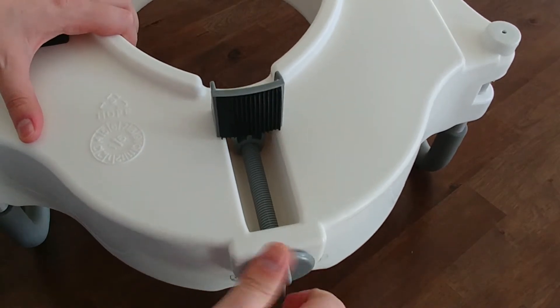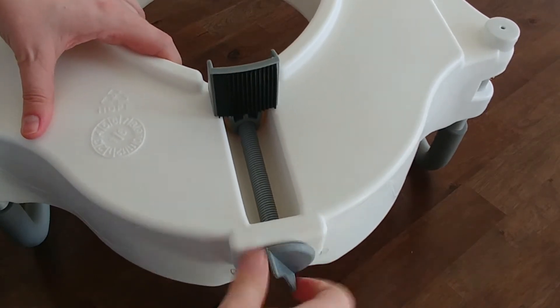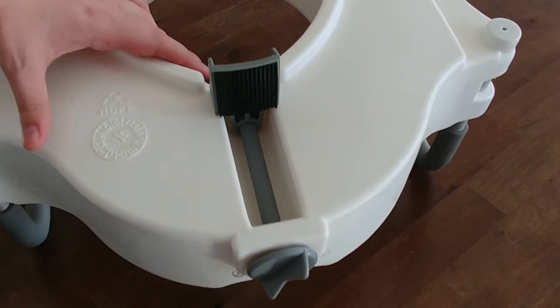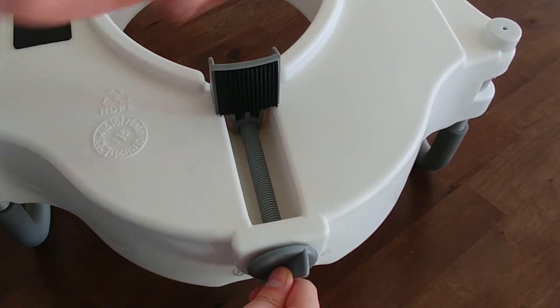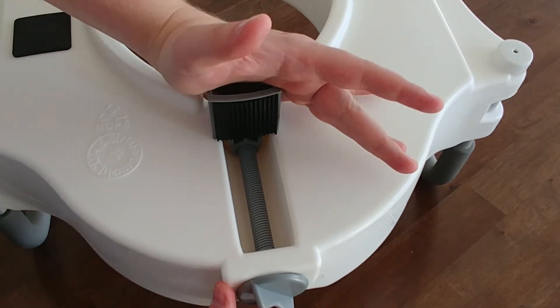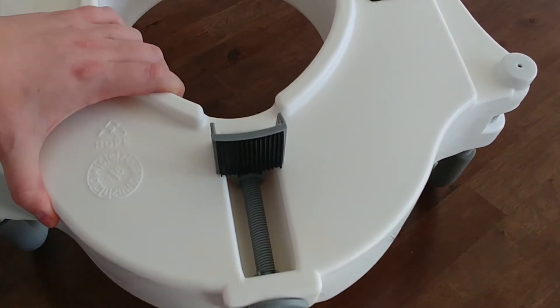Sometimes it'll arrive with the clamp all the way in the back, and what will happen is this knob will just turn and turn and turn and nothing will happen — it won't move. What you've got to do is, basically this just came unthreaded from the screw. Grab here, kind of pull it toward the knob while you turn the knob to tighten it, to get the threads to catch again, and it should turn without any trouble.